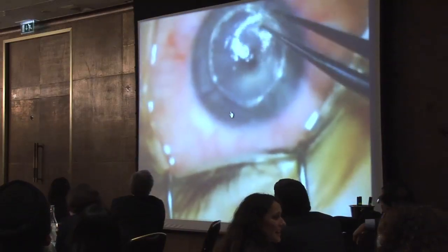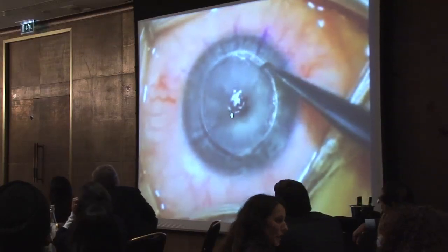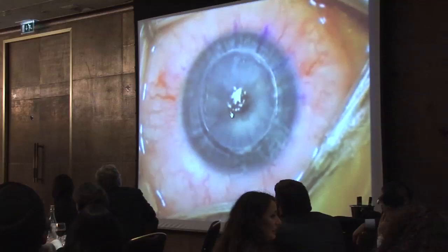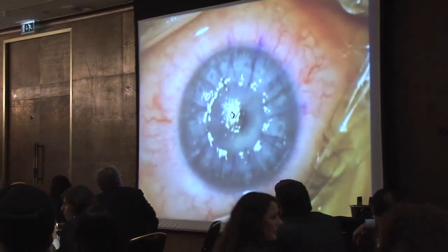This is new cornea without the Descemet's membrane. Healing is faster than after PKP, and so this is the result.